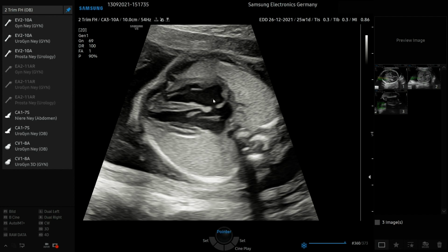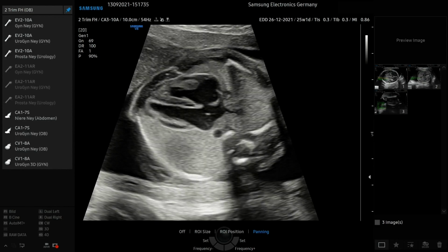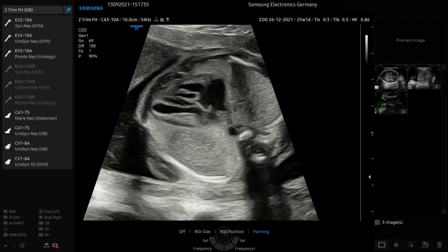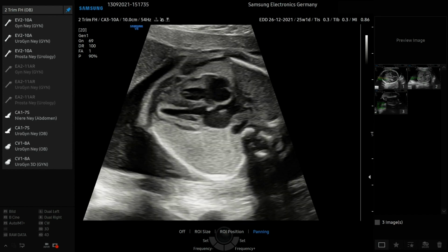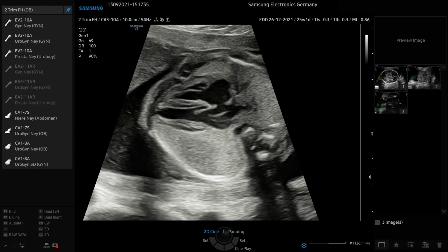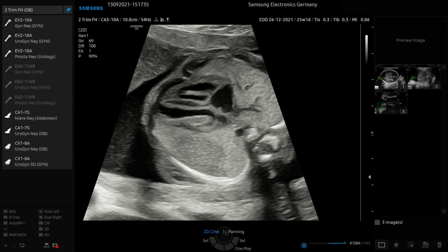You see the foramen ovale, the flap of the foramen ovale, and when we run the image again, see how the flap moves and the atrioventricular valves are arranged. You see the smooth appearance of the leaflets of the valves. You see that the valves are open here and closing here.